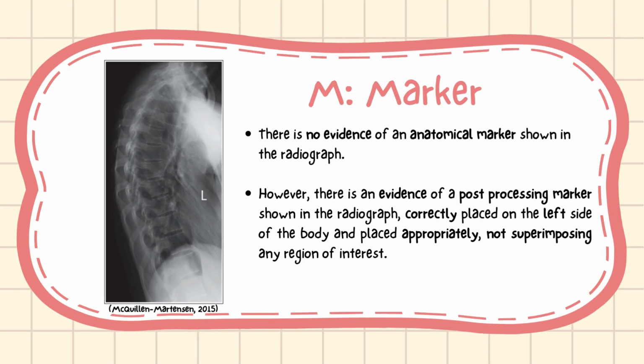Next is marker. There is no evidence of an anatomical marker shown in the radiograph. However, there is evidence of a post-processing marker shown in the radiograph, correctly placed on the left side of the body and placed appropriately, not superimposing any region of interest.